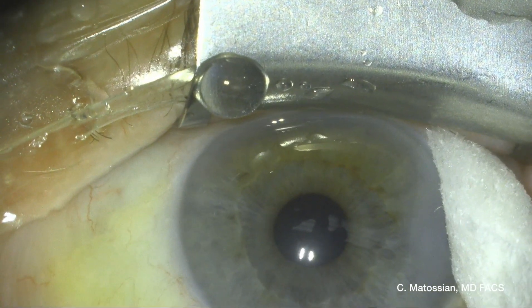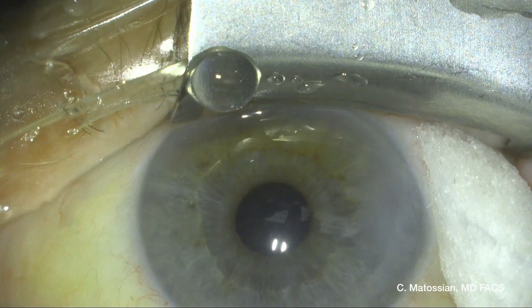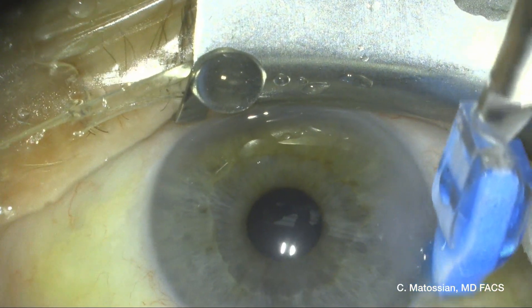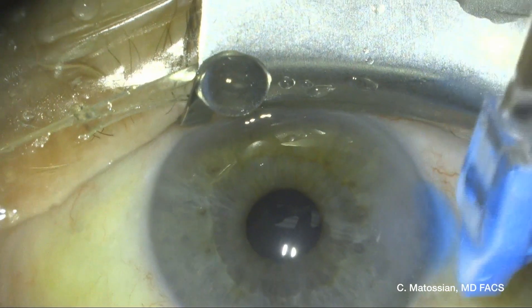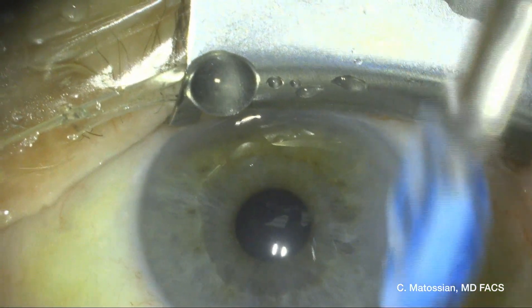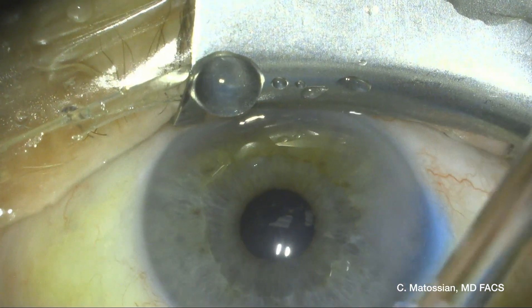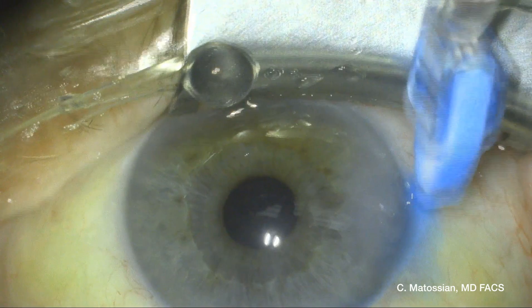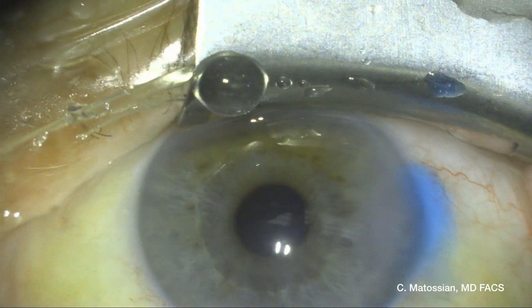As you can see, I'm applying the Reshore sealant, painting it on along the temporal incision, as well as dabbing it over the side port incision. The Reshore sealant polymerizes within 7 to 10 seconds to make sure the wound stays nice and watertight.